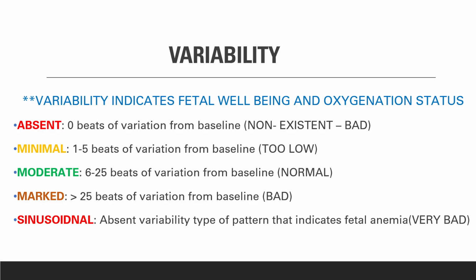So you may see minimal variability. However, there are times when that's appropriate, as long as you know what the cause is, and how to intervene appropriately to make sure that it doesn't stay permanent.